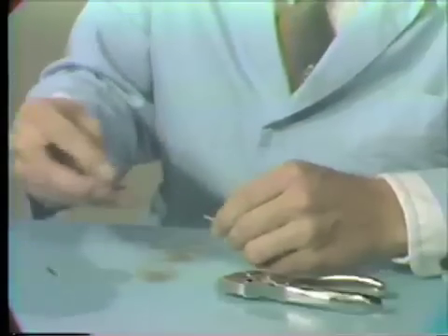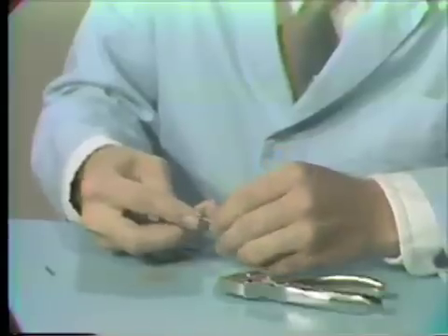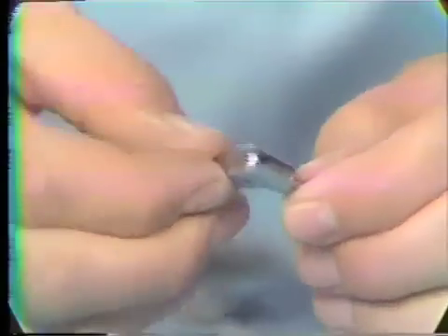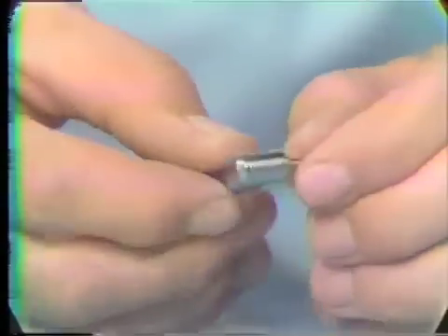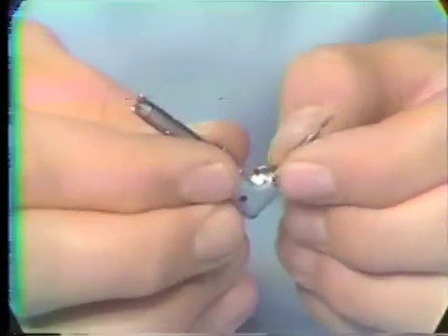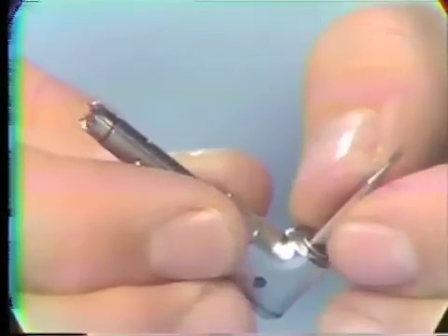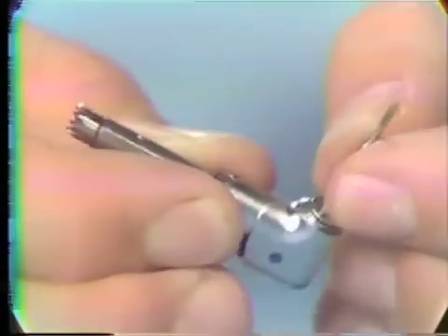At this point, check it in the handpiece. The latch is latched in place, the burr is firmly in, and you check it for rotation. You can see the burr is rotating and it's not binding up, and it's also firmly in place.